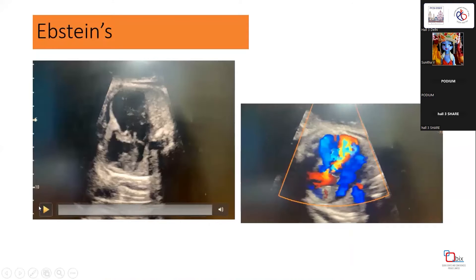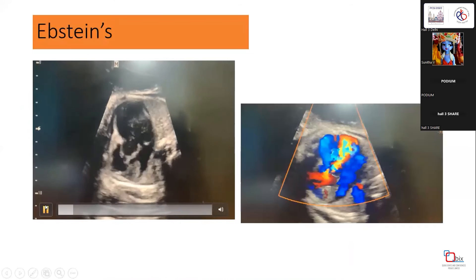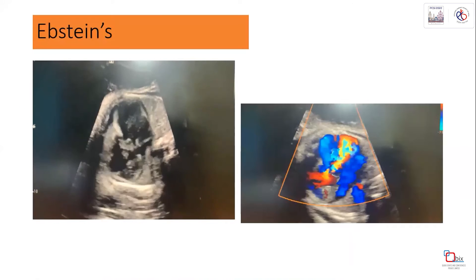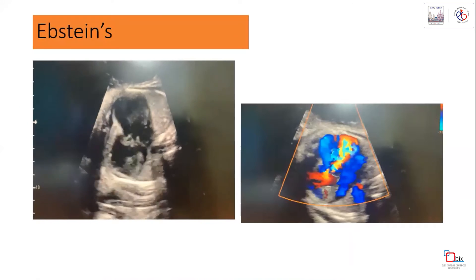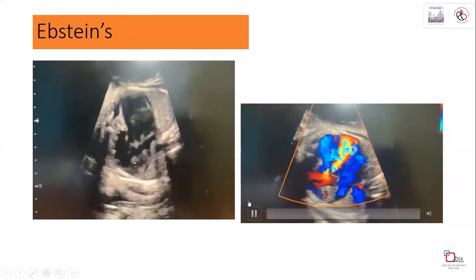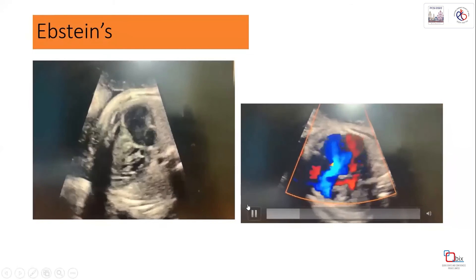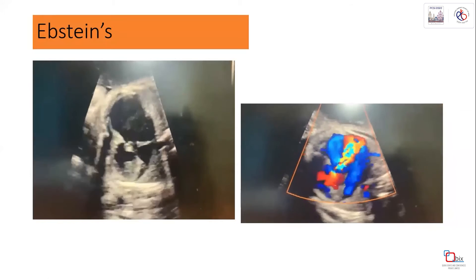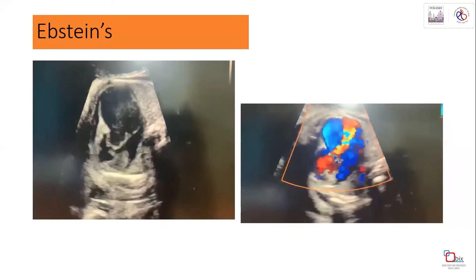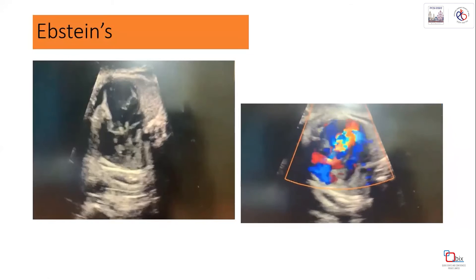This is a case of Ebstein anomaly where the tricuspid valve is completely displaced towards the apex. The color flow jet is also directed toward the apex. This case had a very poor prognostic score and was referred to a pediatric cardiologist.